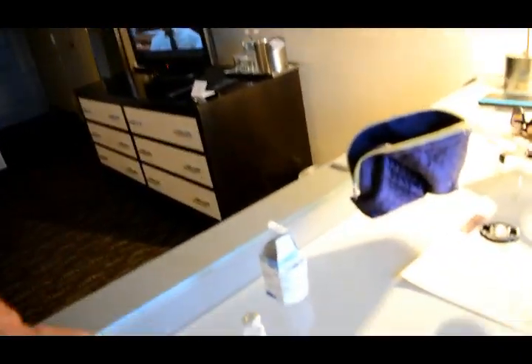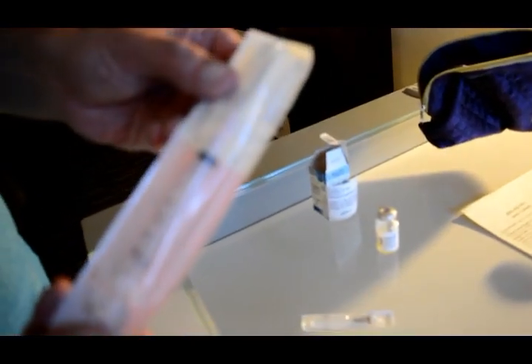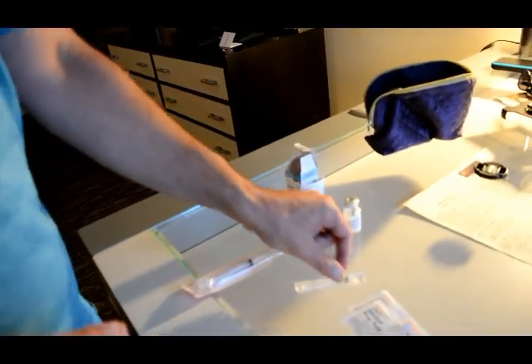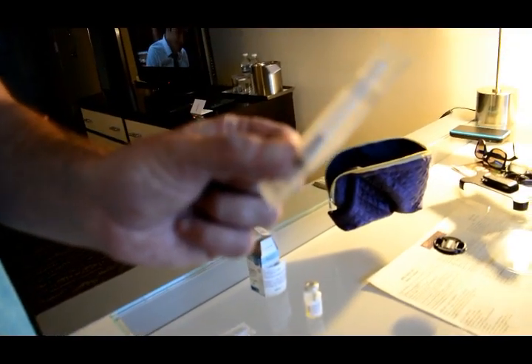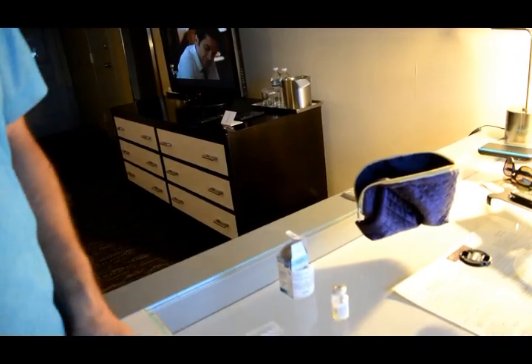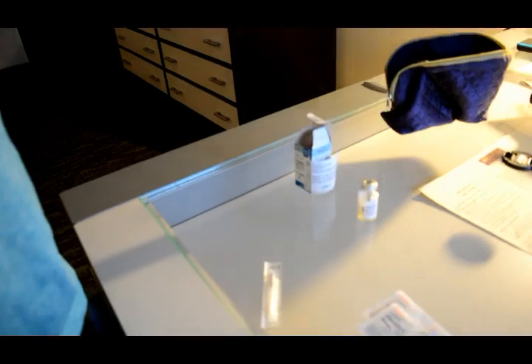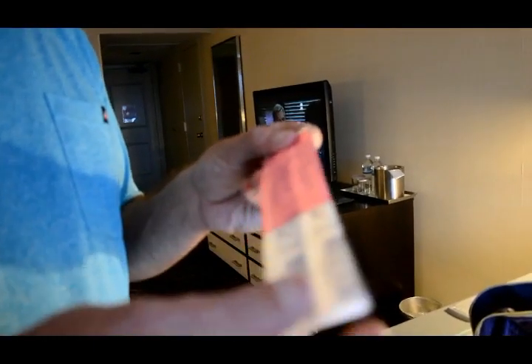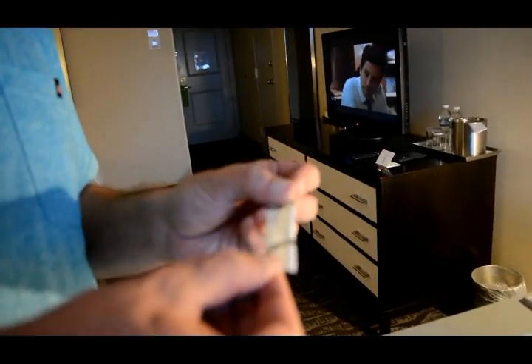Let's go over what we're going to need for today's progesterone in oil injection. We have the progesterone in oil vial, our syringe with the drawing needle already attached — an 18-gauge — and the injection syringe, which is a thinner 22-gauge needle that will hurt a lot less. And we have alcohol pads for sterilization.